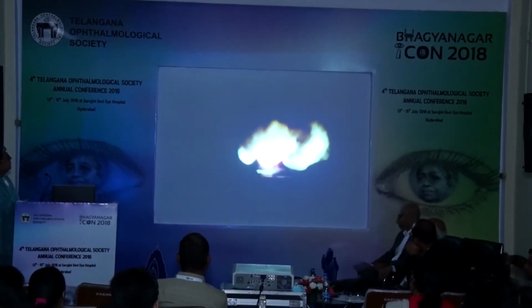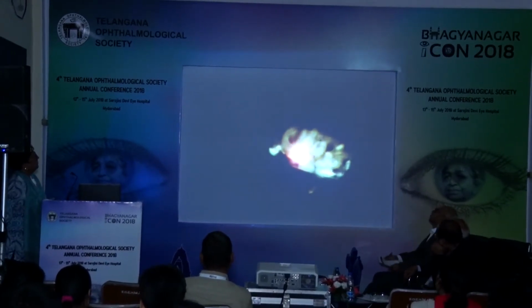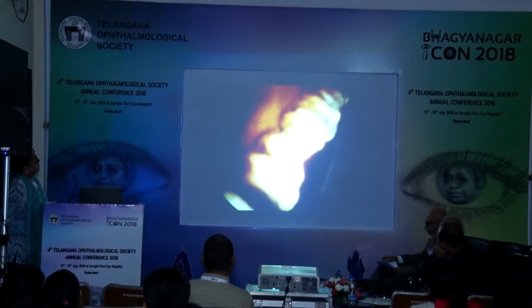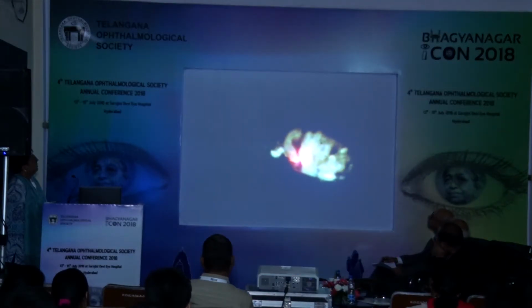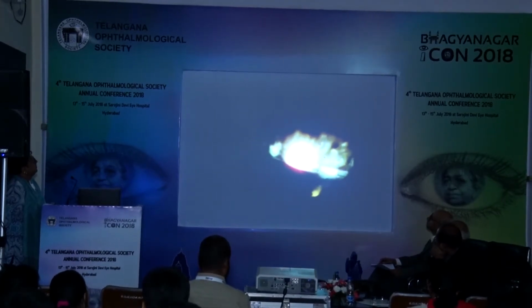It is important to start lasering at the posterior tail aspect of the ciliary processes and to observe the processes retreat posteriorly. The end point of laser treatment is marked by adequate shrinkage and whitening of the ciliary process.